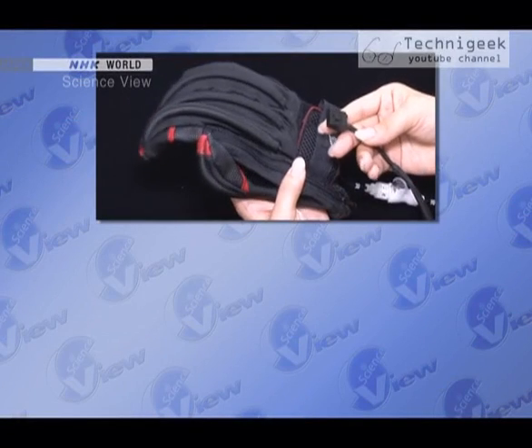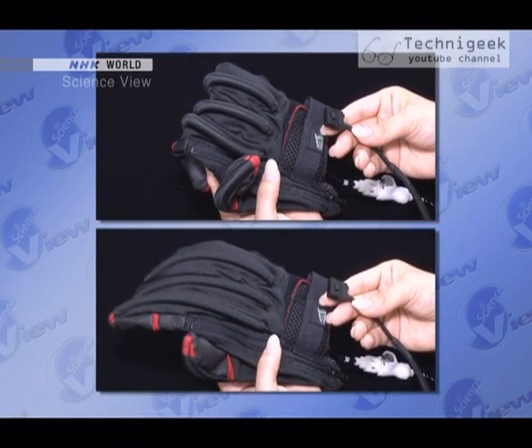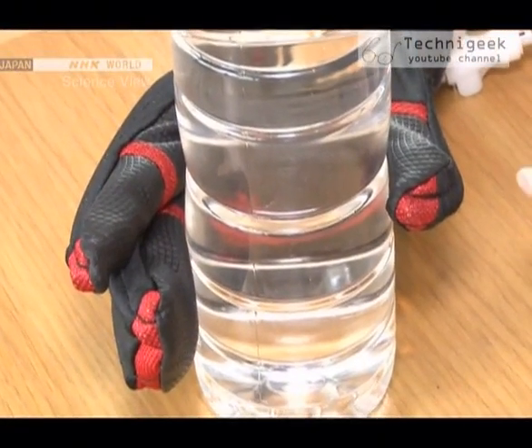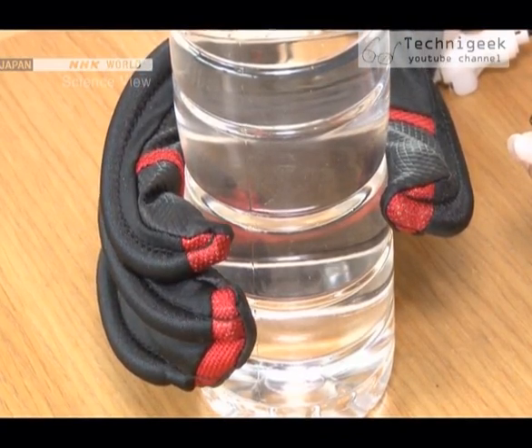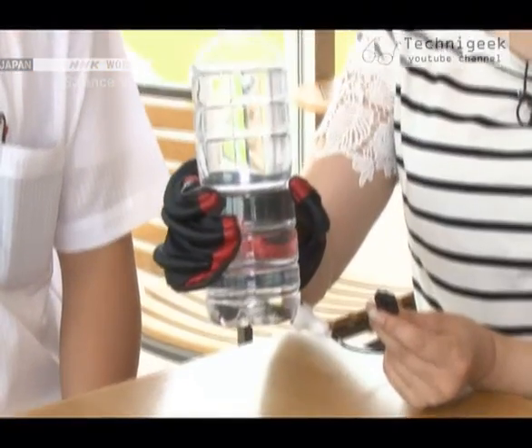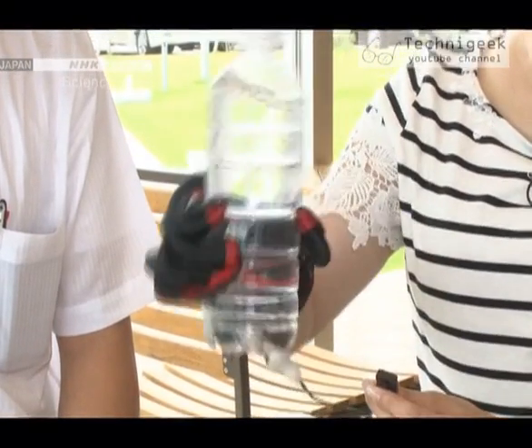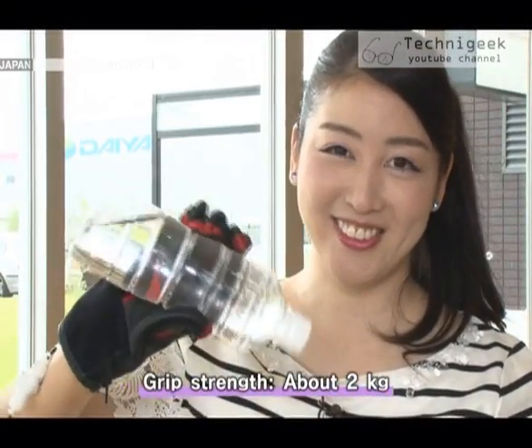When you press the button once, the glove curls up. And when you press it again, it opens up. We tested its function with a plastic bottle that contained 500 milliliters of water. I'm not putting any force on it, but I can lift it up. The grip strength is about 2 kilograms.